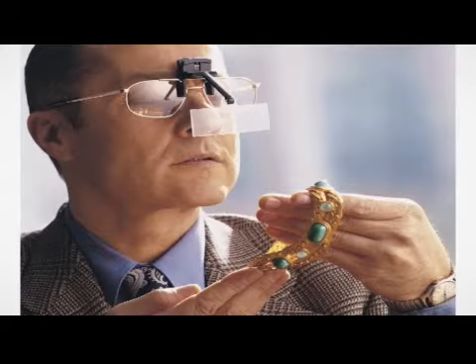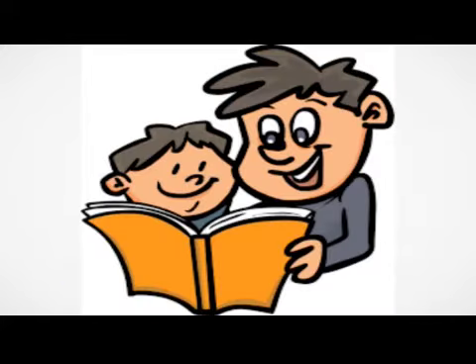Spectacle magnifiers. Put them on while seated at the place for reading. Take the book in both hands. Sit in an upright, normal position. Hold the book at arm's length. Move the book slowly nearer till letters are clear. The right distance is crucial. Start reading by moving the book slowly from left to right in a steady movement, keeping the same reading distance. Rest elbows against sides.